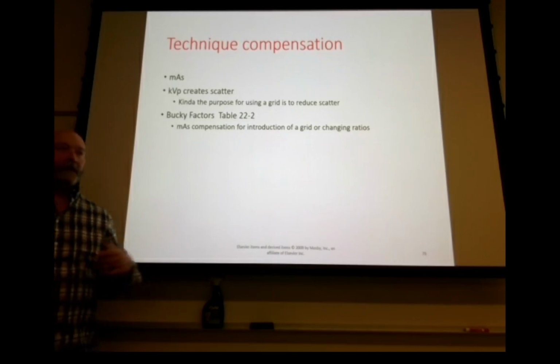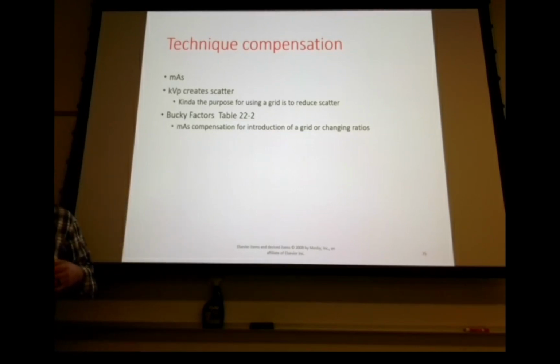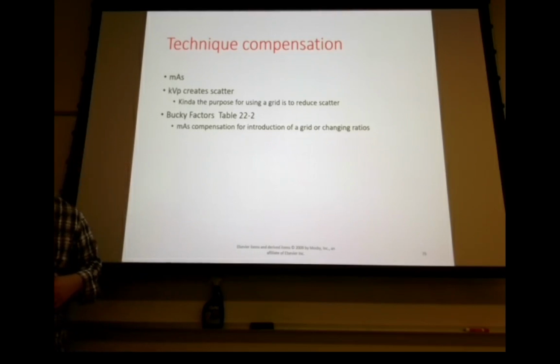So even though those are rules of thumb, and you're going to break them in two different ways if you're shooting an abdomen for a feeding tube, everybody's abdomen is over 10 centimeters unless you're looking at a pediatric patient. And your KUB, what kind of kVp are you using for KUB? 80, 85, yeah.